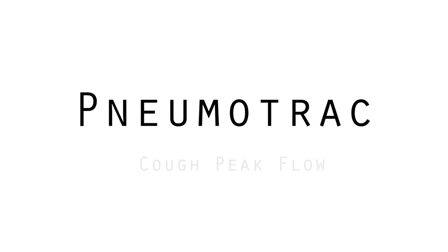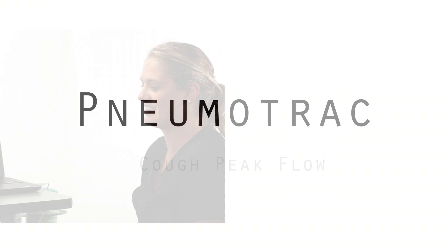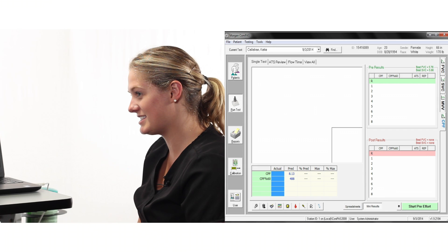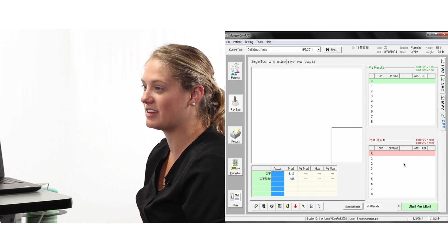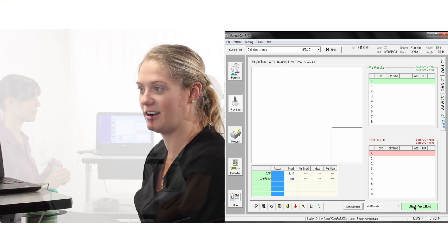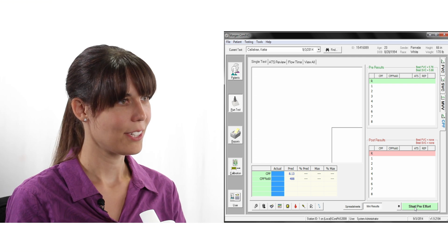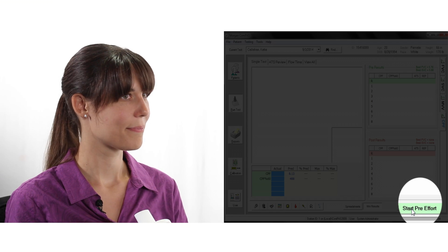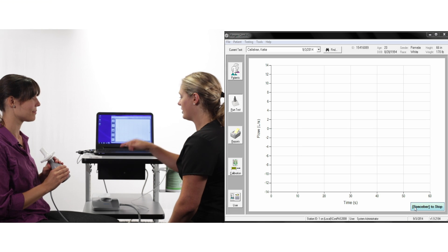Performing Cough Peak Flow on the Pneumotrack. The cough peak flow is the velocity of air being expelled from the lungs after a cough maneuver, usually from maximum inspiration.